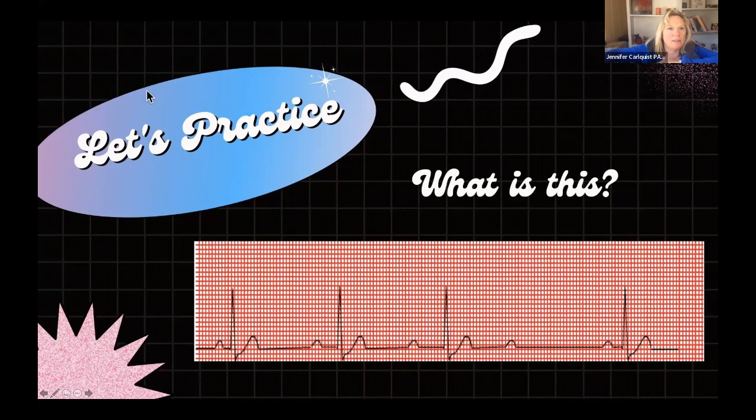Okay, let's walk through it together. So here you have your, oh, that's not a good color. Let's switch. Here, let's do blue. You've got your P. That's getting long, longer, longest, and then drop, rinse and repeat. So again, this is a Wenckebach. Yes, no worries. Type 1 Wenckebach. Yep, you guys are right.